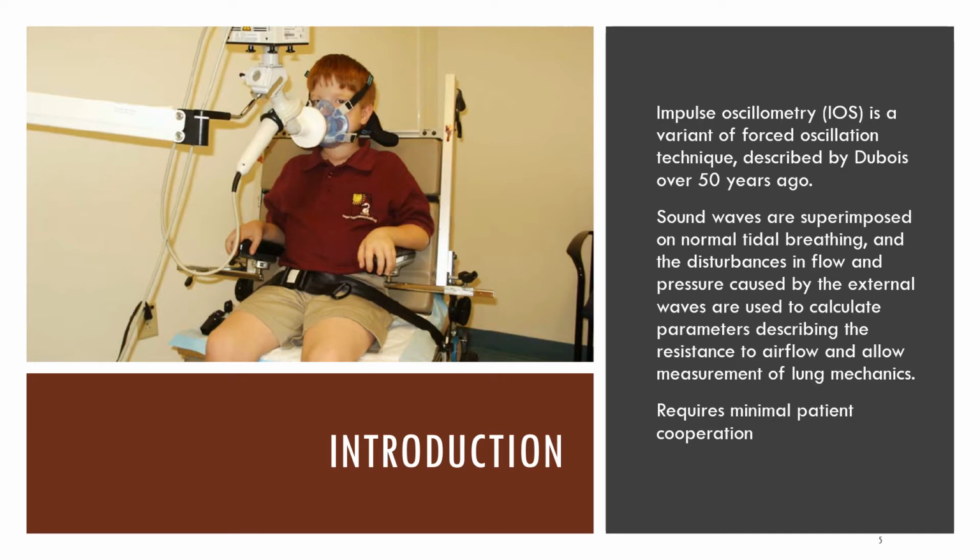Sound waves are energy waves, and what they can tell by the disturbances in flow and pressure caused by these waves. And then they have some special calculations where they can describe different resistance of airflow. They can also talk about reactive parameters in the airway.